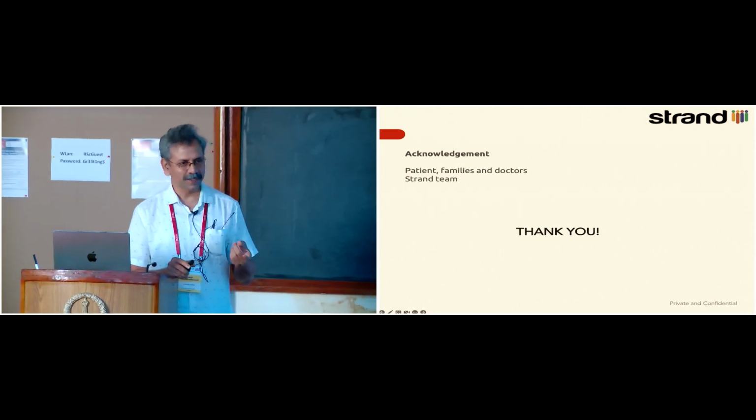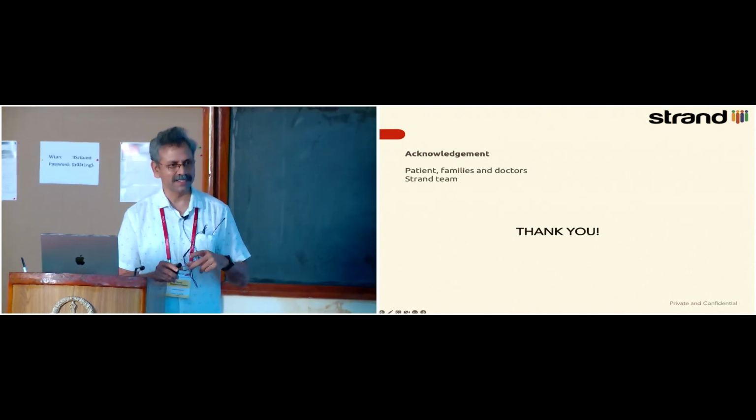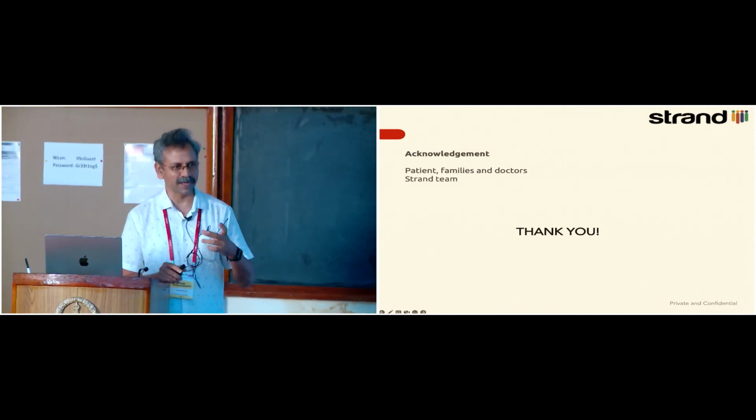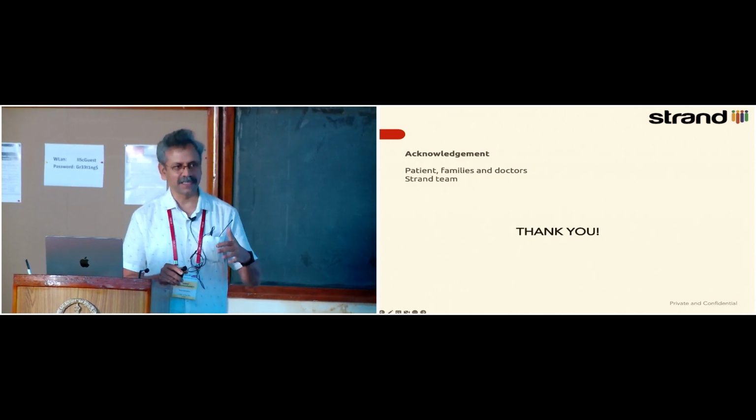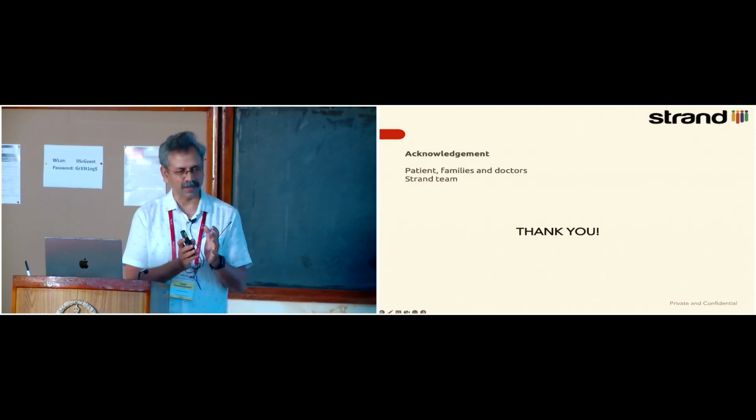For clinical reporting, you need to freeze on your SOP. You need to describe exactly which profile you're going to use, and anytime you change anything, you need to have the documentation trail about why you changed it and so on. So you could think about the profile itself, updating it once in a while, so that, as your laboratory kits and all are changing, maybe the profile is changing slightly, keep updating that.